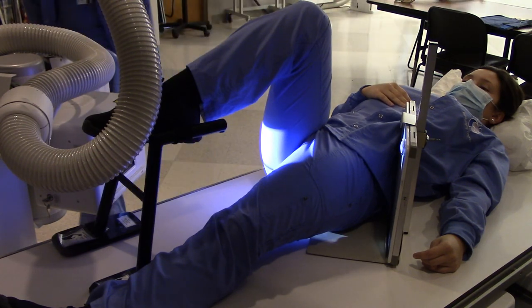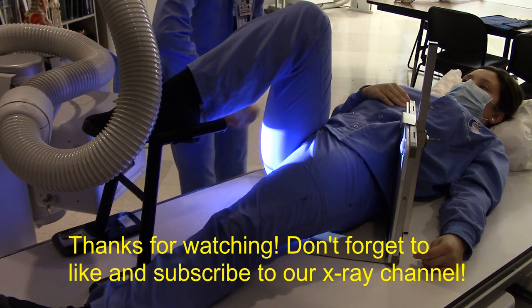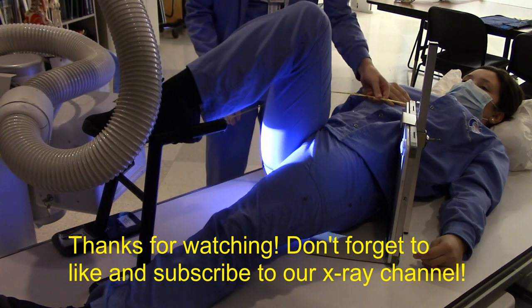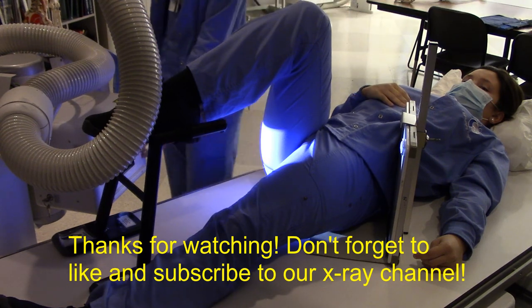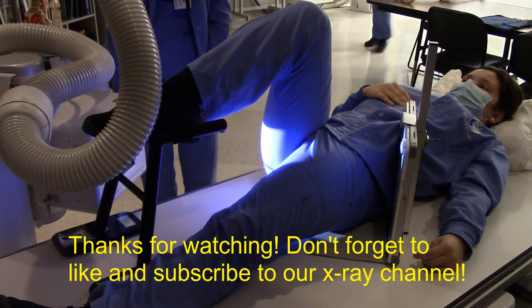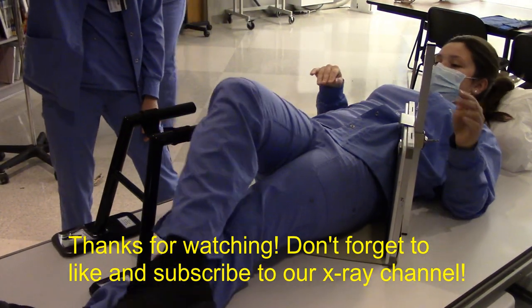Shield. We've been getting slack about shielding lately, so I'm going to try to remind you all of that. That's real good — cool, for sure, absolutely. Thank you.